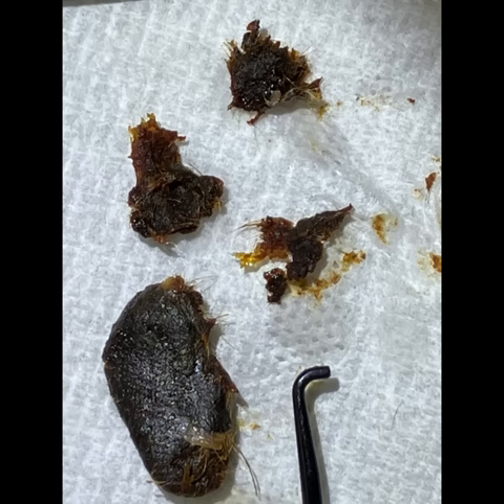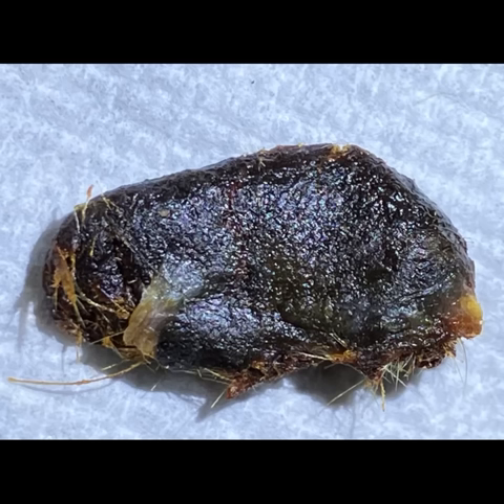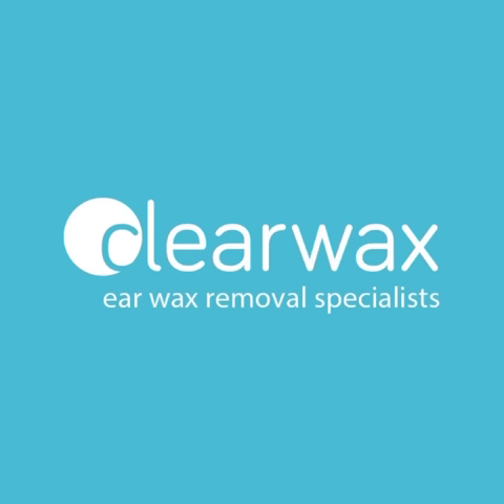So that's all the wax that I removed, and I've got the ear hook there to give some perspective. This is a close-up of that large plug — the last plug that I removed. Just see how dark it is, so we know it's been there for a while. The darker the earwax, it's oxidized within the ear, so it's been there for longer.